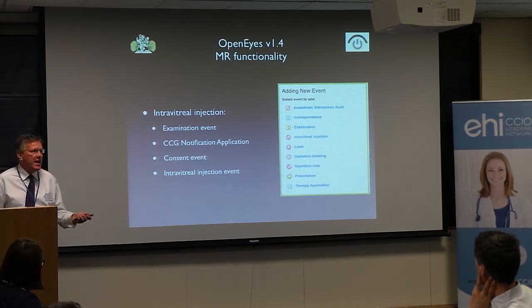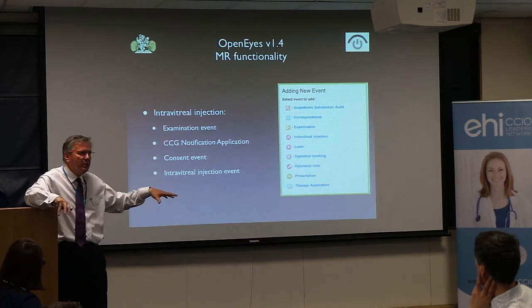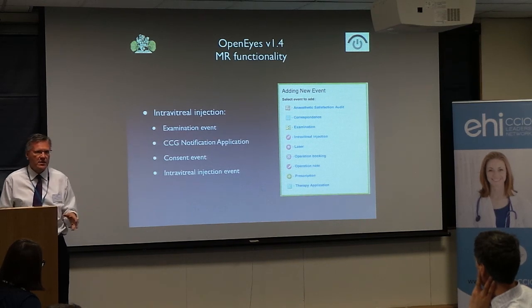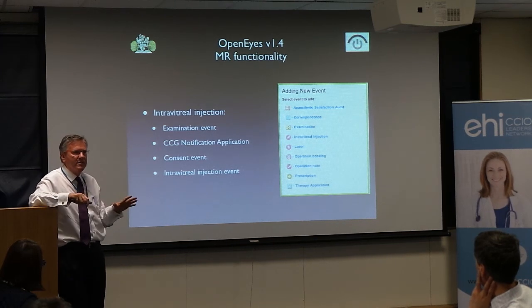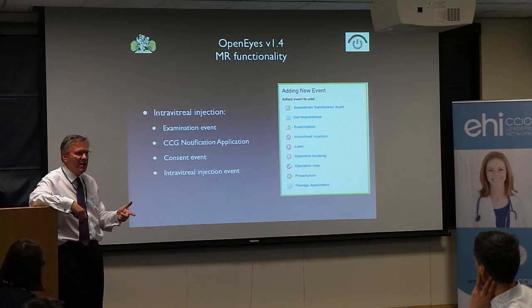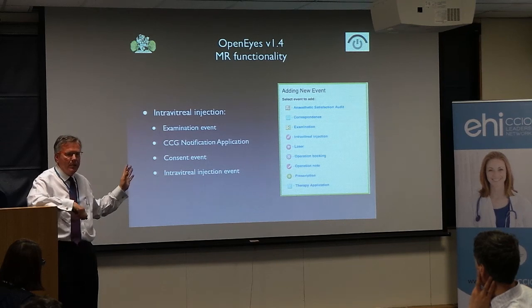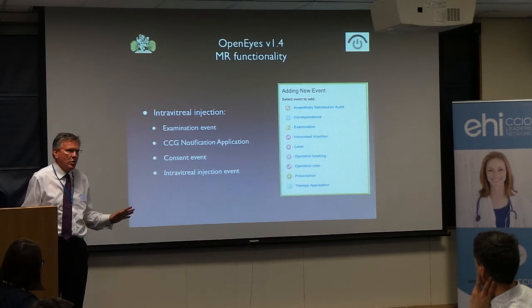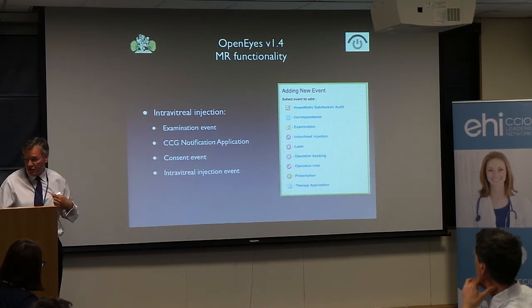So the challenge is to get them to enter the data once and to pull that data through, where possible, to all of those events so that they're not having to put the same stuff in twice. Open Eyes is all about removing the barriers that would prevent someone from using the system and giving them every possible incentive to use it, because we're fully aware that you can have the best system in the world, but if it sits on the shelf and people don't use it, no matter who you are, it is dead. So compliance and use rules everything that I do in this project.